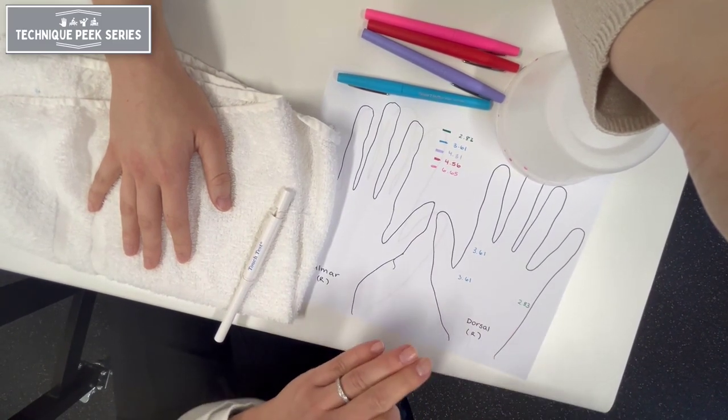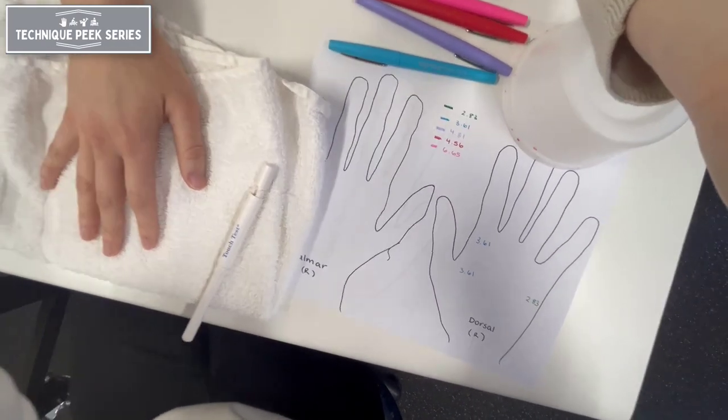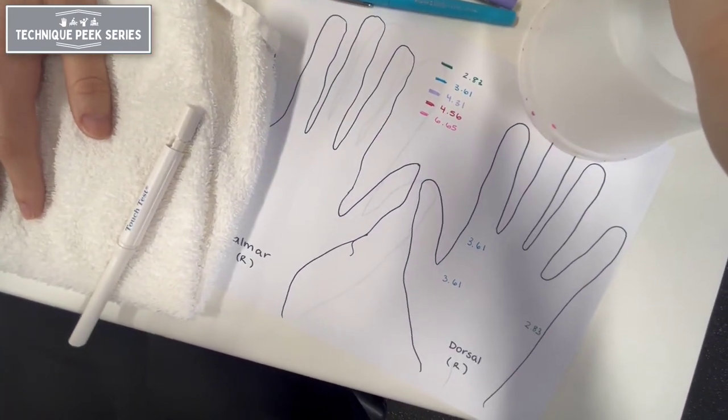The chart shown here has both a volar and dorsal representation of the hand, where you can notate your findings.